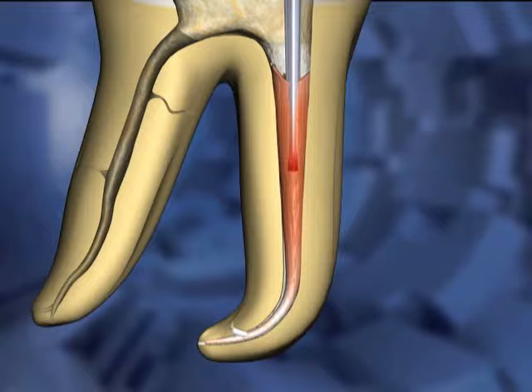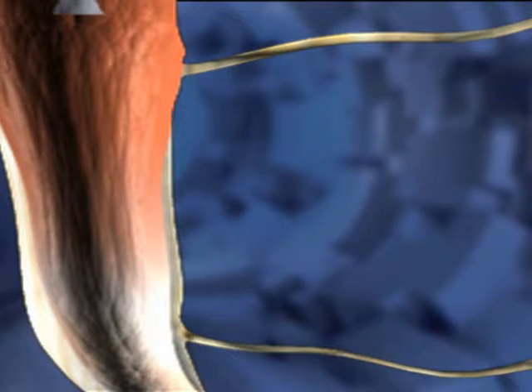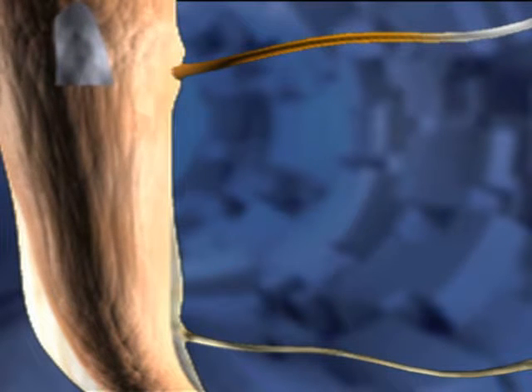In this animated example, the carrier goes about one-third of the way down into the canal space. The heat is turned off while pressure is still being applied to the carrier. This forces Gutta Percha and sealer into canal irregularities in the coronal portion of the canal space. This cooling period pressure lasts about five seconds.